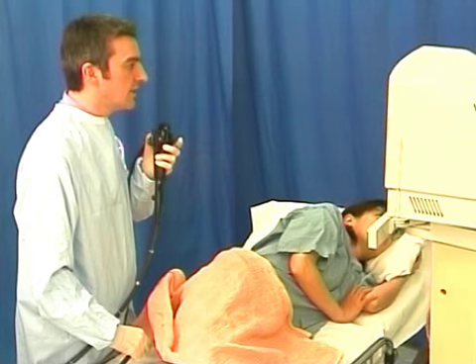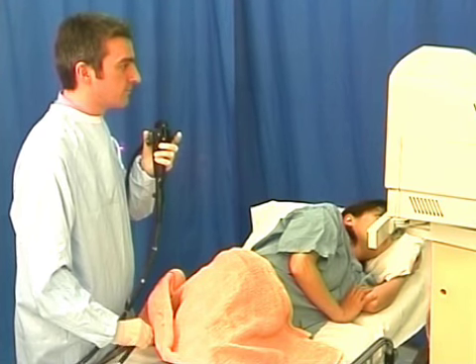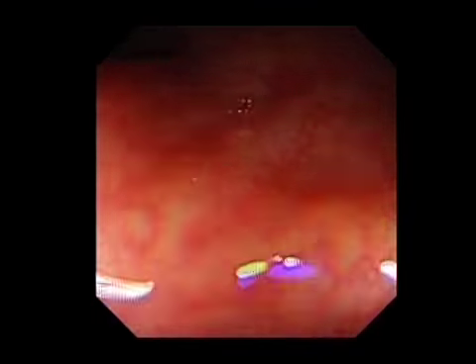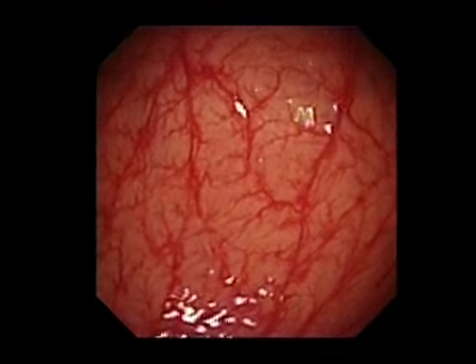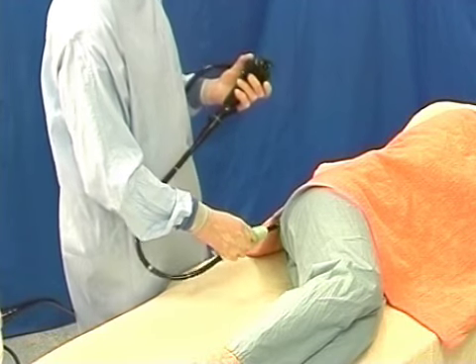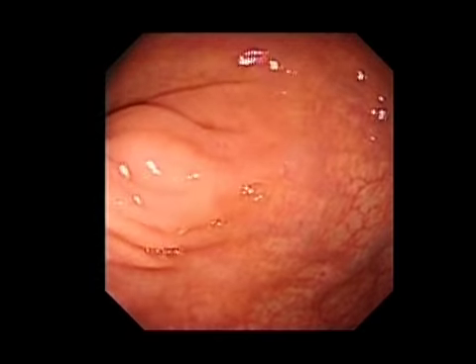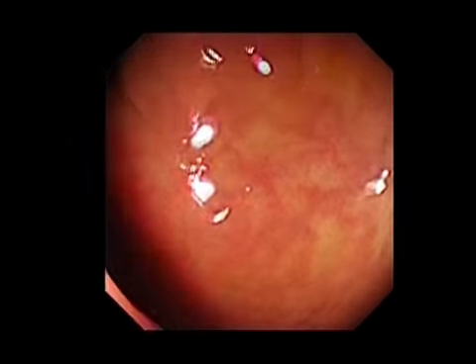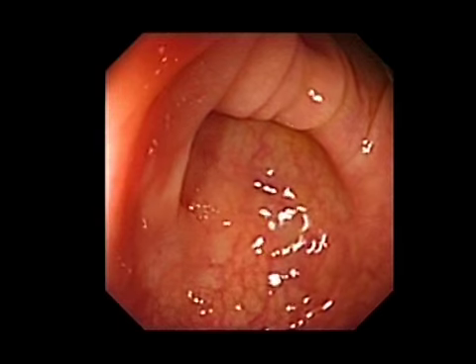The endoscopist should concentrate entirely on the screen view, even while talking to the patient. It takes concentration to follow the lumen in close-up, avoiding mistakes and redouts, and watching the vessel pattern in case the colon rotates. Small, coordinated movements are needed to torque steer or corkscrew through the sigmoid. Steer smoothly, keeping a sense of direction. Slow and precise steering movements avoid losing the view.